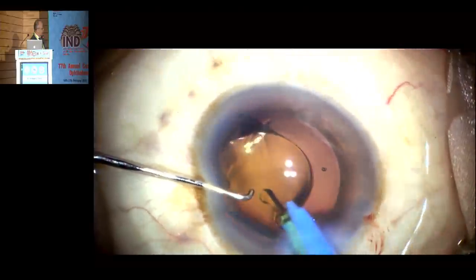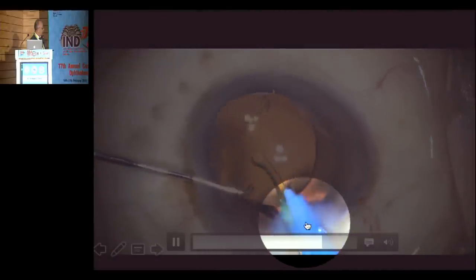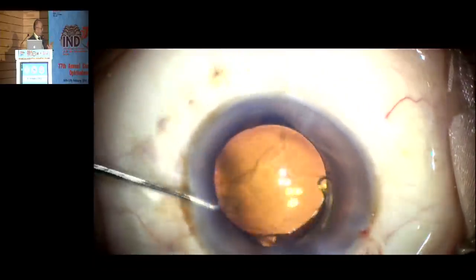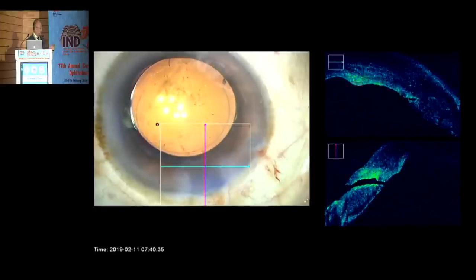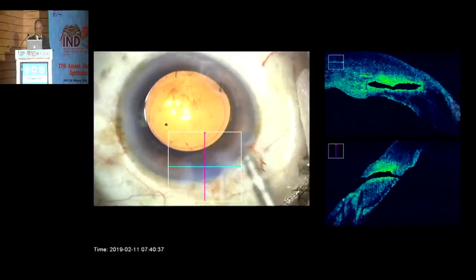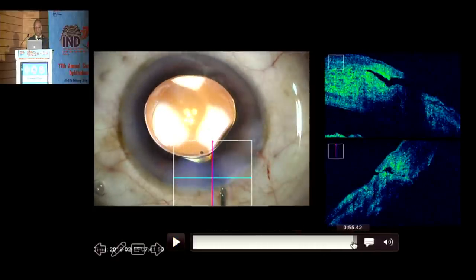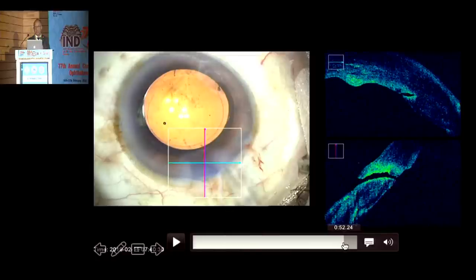Subsequently, the lens opens inside the anterior chamber. With this plunger, you can still manipulate your lens inside also. That's the advantage. The plunger can go inside more than 3 millimeters, and the lens can be manipulated very, very effectively in these cases. One of the most important aspects of any injection is to look for what type of wound integrity you get from these injections.